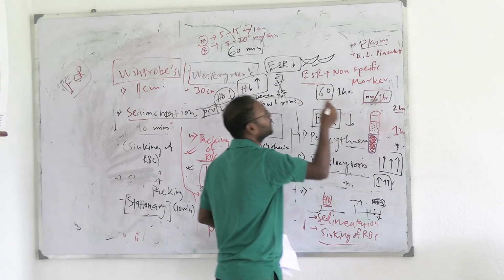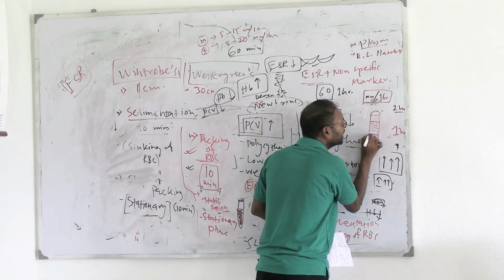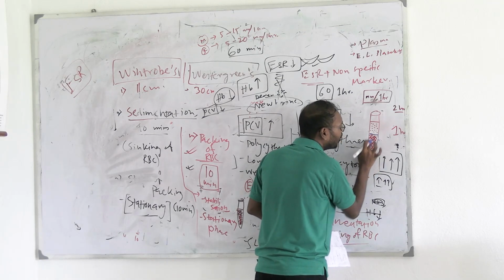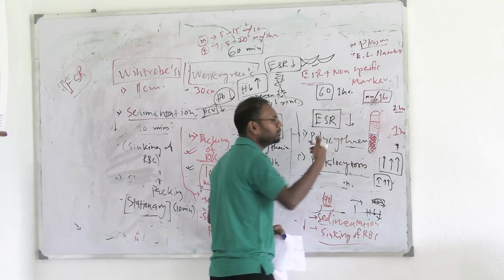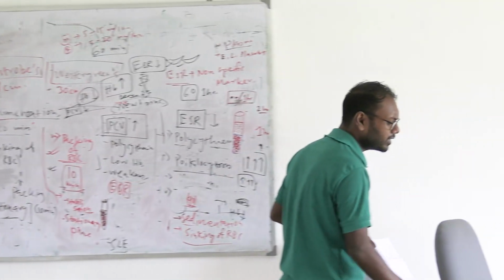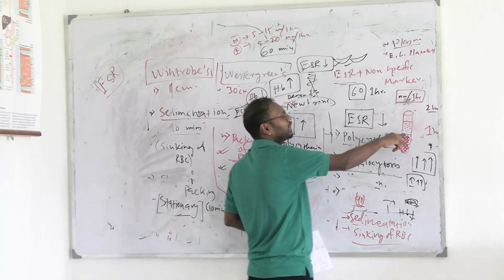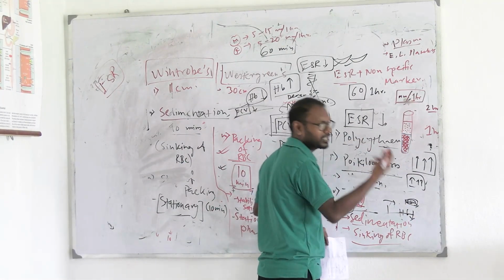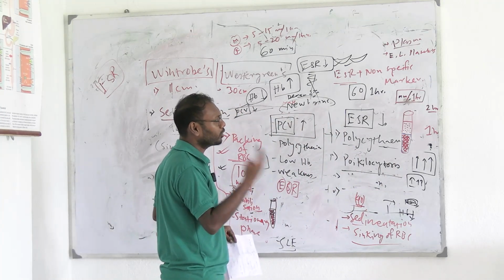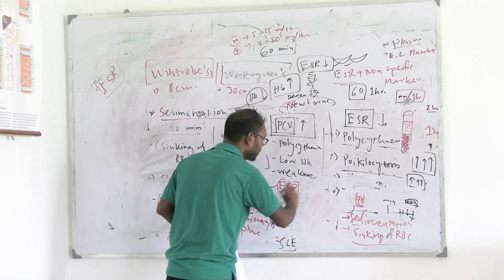But leukocytes and platelets, since they are very much smaller in size, are only taking this much amount. This is the test tube. There is nothing else here, only this much amount. So this is pretty much negligible for us. That's why we don't call it total sedimentation rate. We actually call it erythrocyte sedimentation rate, because almost 96 to 97% of these packed cells are RBCs. So mostly this ESR, or sedimentation rate, is dependent on erythrocytes. That's why the term is erythrocyte sedimentation rate.